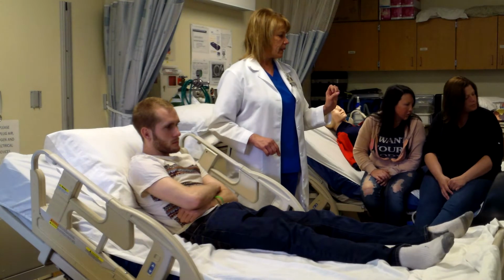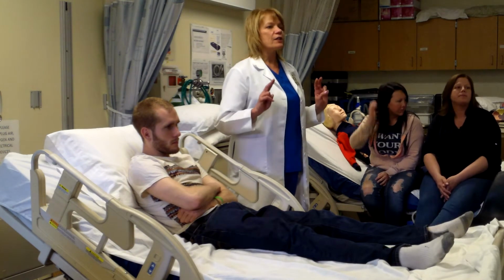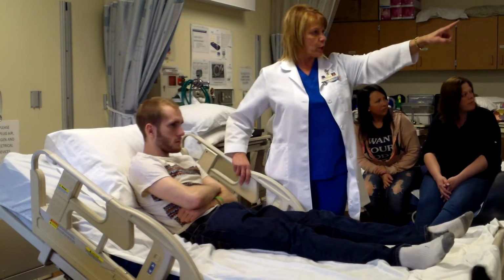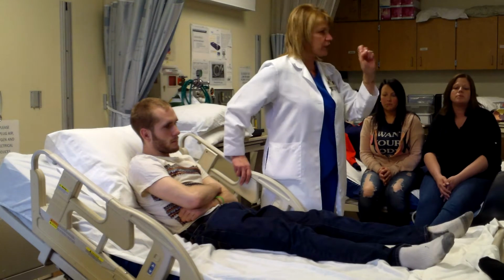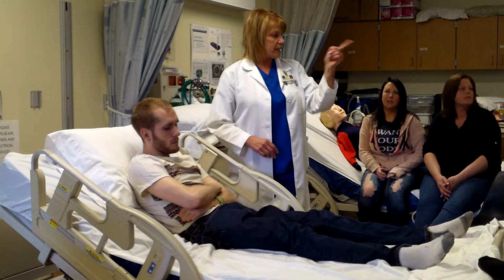See that? Yeah. This is the position for both of those. It's on the board right there too. So it says it's both lower lobes, anterior segments. You've got all these slides as well, so you can double check to make sure you've got your form filled out right. So I have to get the bed into this position.